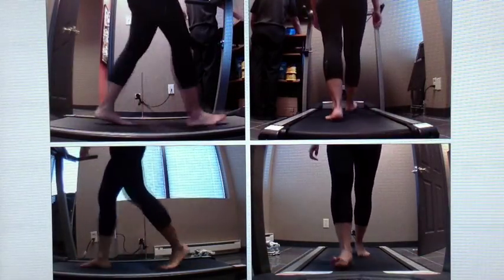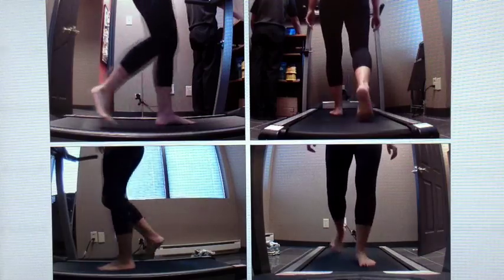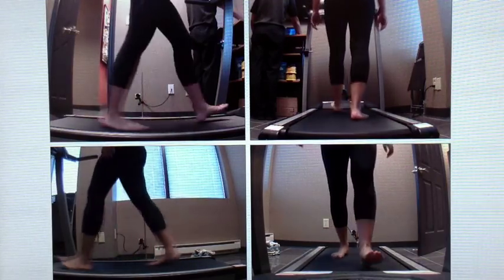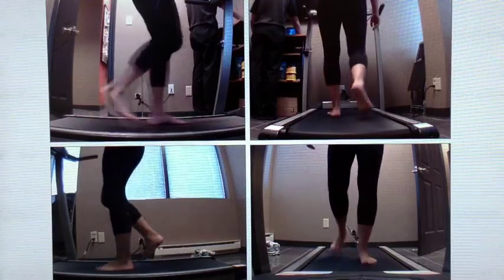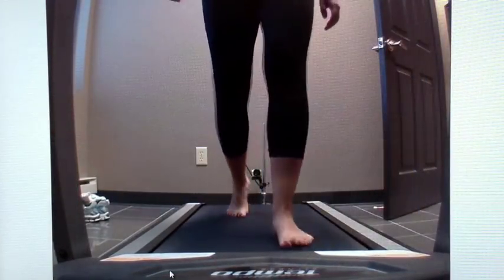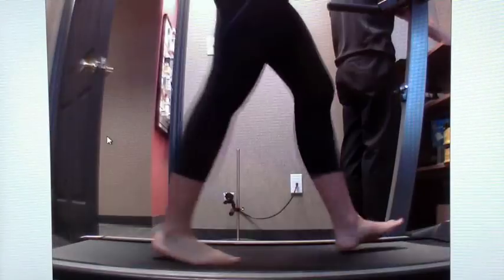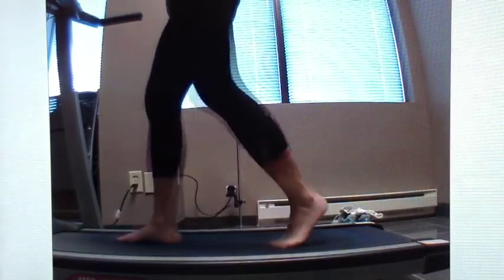The software will then allow us to play back the video recording on a large high-definition monitor for analysis. The main view of the software displays the 4 angles captured during the recording. From there, the video can be enlarged to full screen mode to allow us to see even greater detail from each of the 4 cameras.